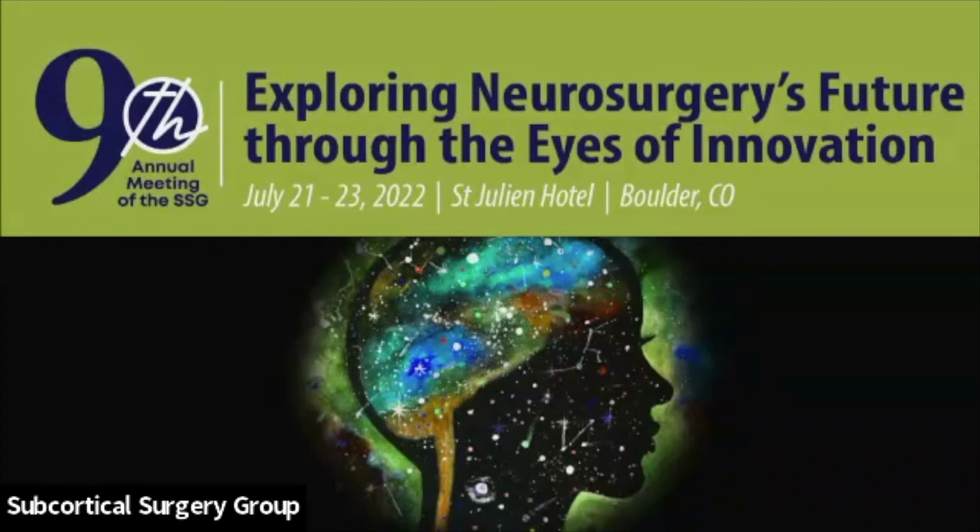I think we want to see more of the tracts that could potentially be injured. The perilesional edema washes them out. So the more you can add in, the better, as far as I'm concerned. But if you add them to the point that it obscures and they're inside the tumor, then you don't know what's tracked. But it is safer to see more than to see less. This is, I guess, my philosophy of it. I'd rather know more rather than adjust this black area there and stimulate and hope that I'm right.